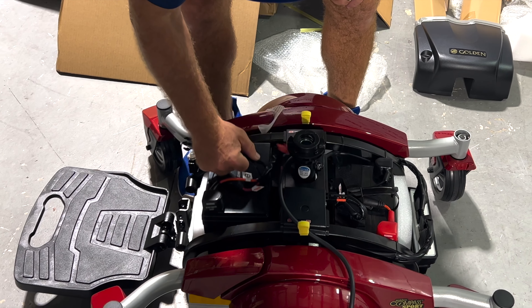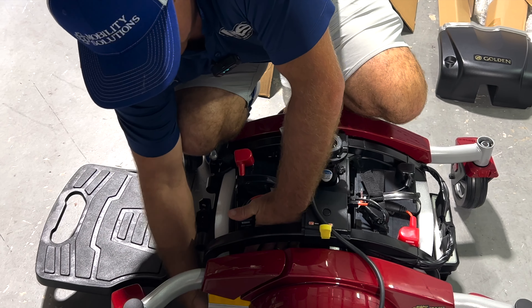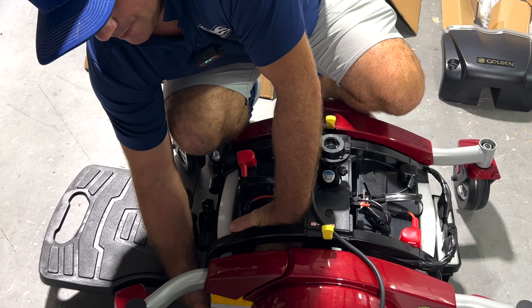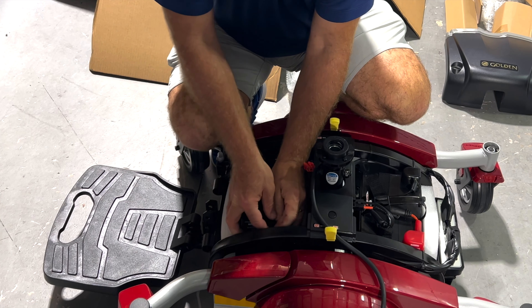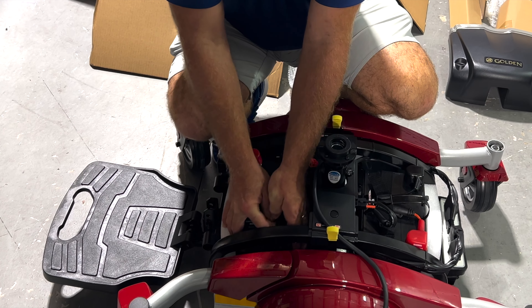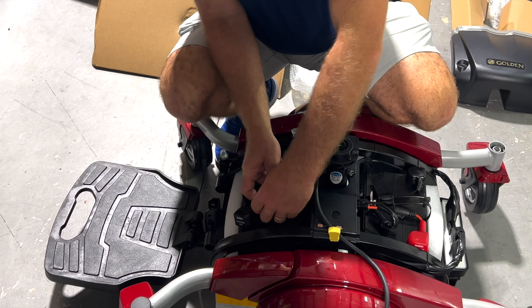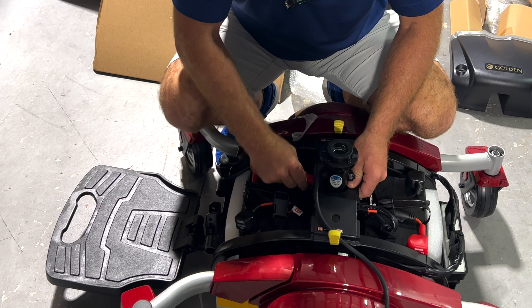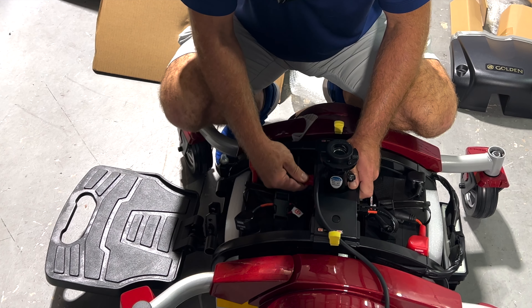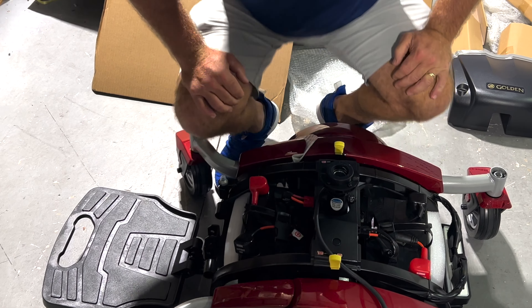I have seen that — suppose we're talking about premiere units, I'm not going to name names — but they keep their batteries plugged up for long periods of time, and by the time you get them, they're bad. I'm not going to name names, but they act like they're the best in the business. The biggest issue with a lot of stuff is batteries.